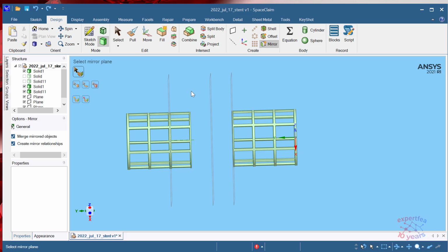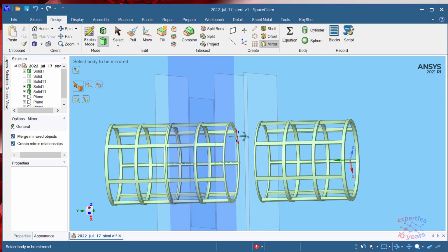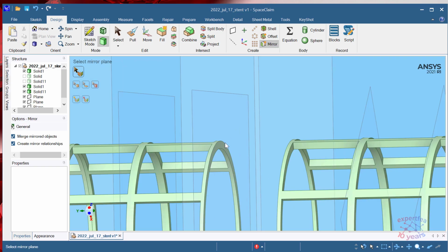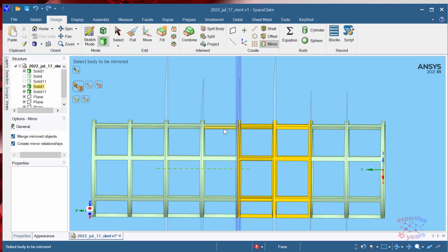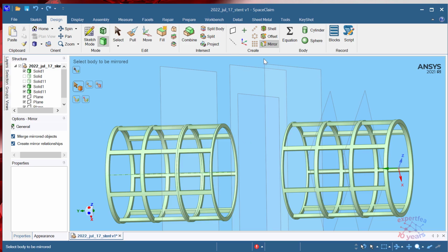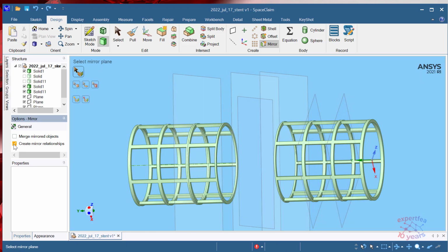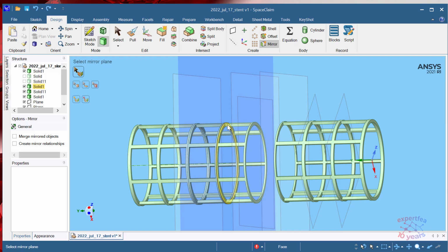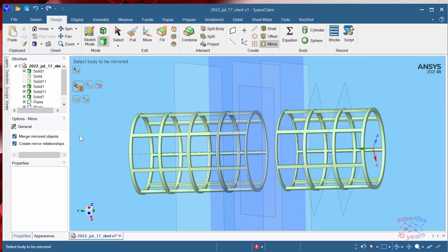Let's see if I can hit a mirror. Mirror this part here. Yeah, it's nice. Let's repeat the mirror. Mirror according to this only. It doesn't mirror once, it mirrors more, because it merged here. Let's uncheck the merge thing. Mirror this. Don't merge, don't create mirror relationships. Yes. Mirror with these faces, don't merge, don't create. Yep.